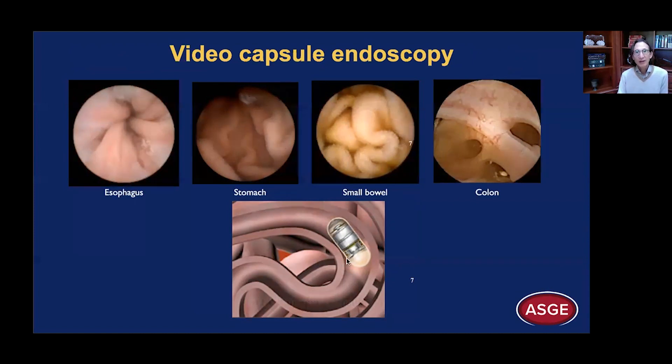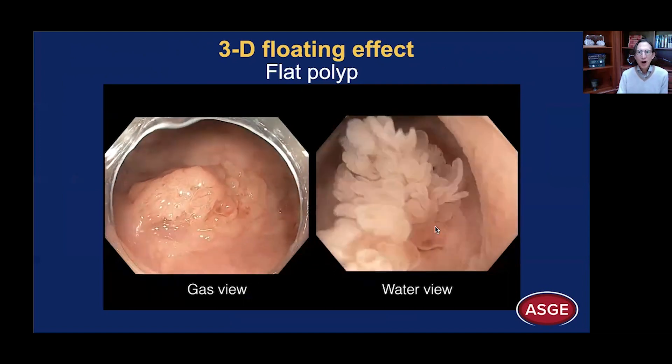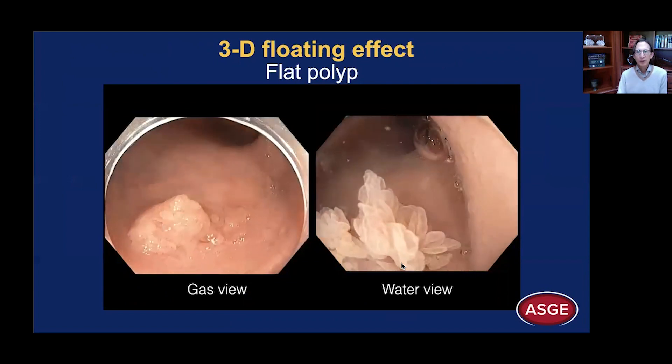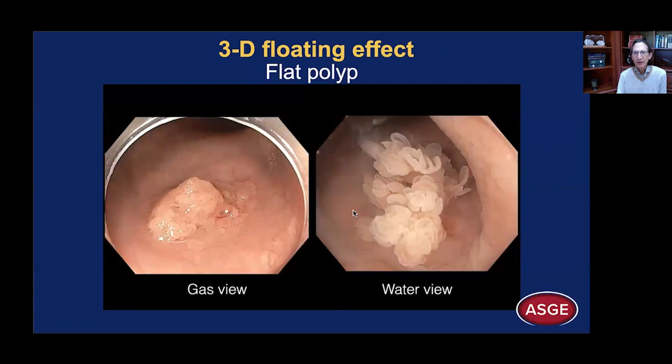That is why we have likened capsule endoscopy to that fantastic voyage of a submarine, submerged in water, traveling through the length of the GI tract. We get this 3D floating effect, which can be quite remarkable. Here, with the gas view, you see a lesion that looks fairly flat. After water submersion, it's floating upwards and you can see the individual villi — even the vascular pattern of these villi. The villi here are just collapsed and flattened by the gas distension.